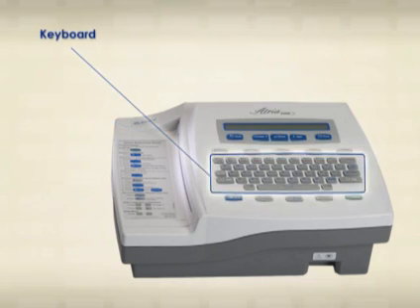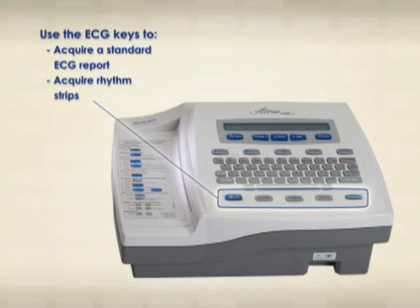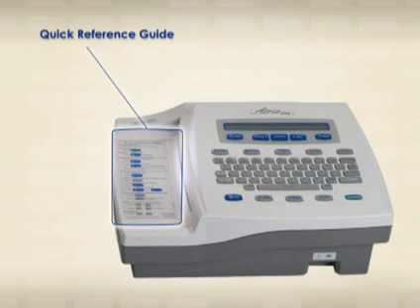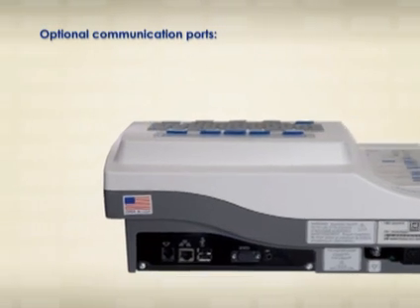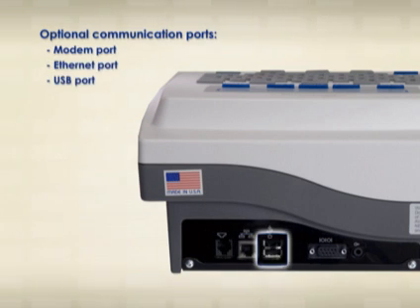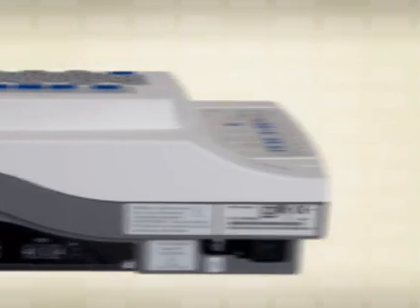The keyboard features a full alphanumeric keypad and designated quick keys. Use the ECG keys at the bottom of the device to generate reports and rhythm strips. The power key turns the device off and on. On the left side of the device, you'll find a handy, quick reference guide. Communication ports are located on the back of the device. Moving from left to right are the modem port, Ethernet port, USB port, serial port, and analog output.